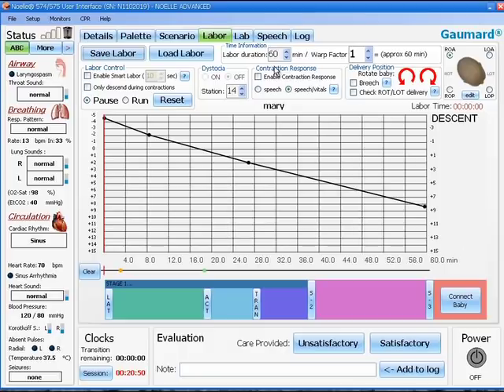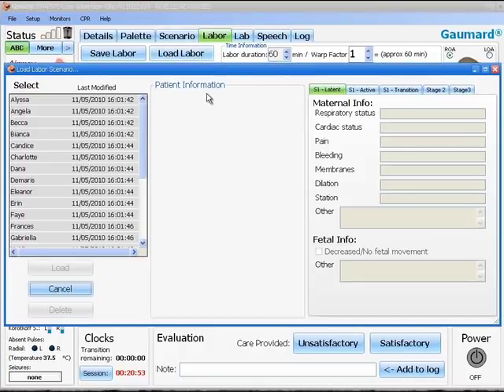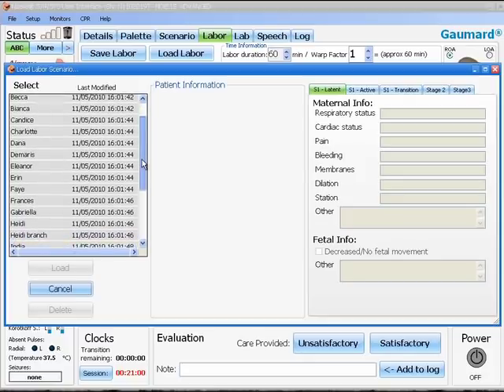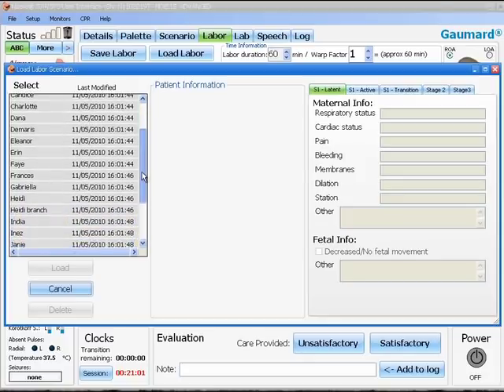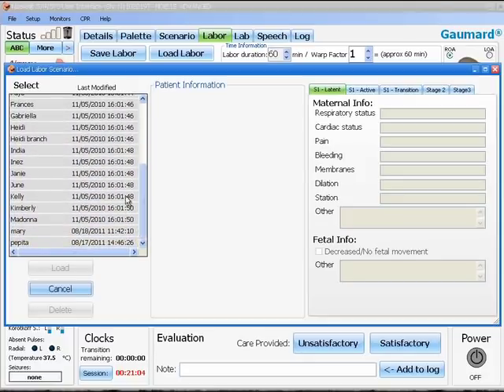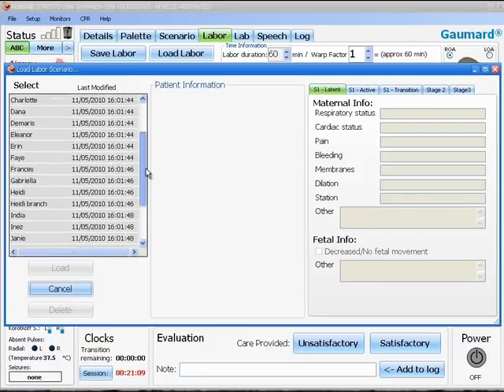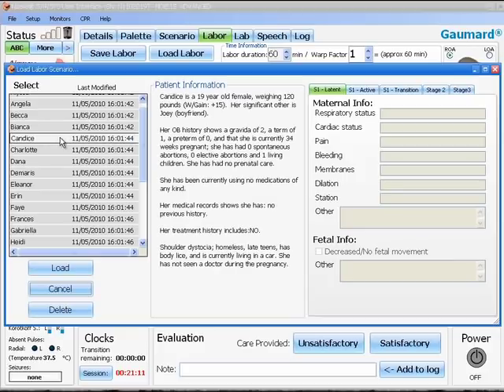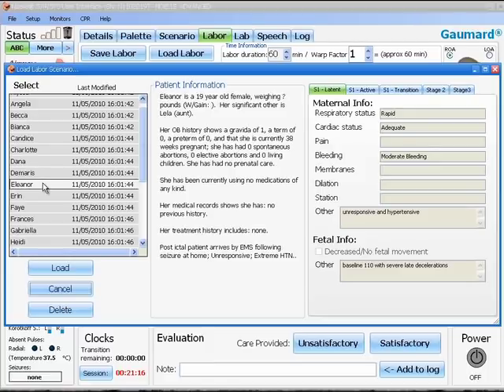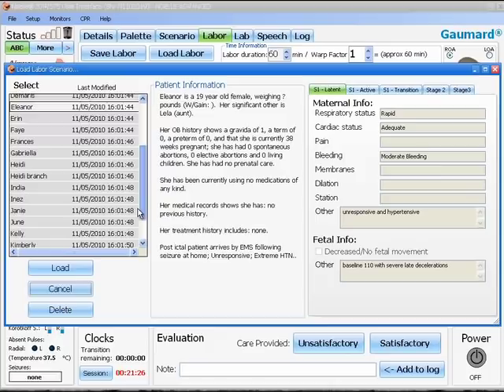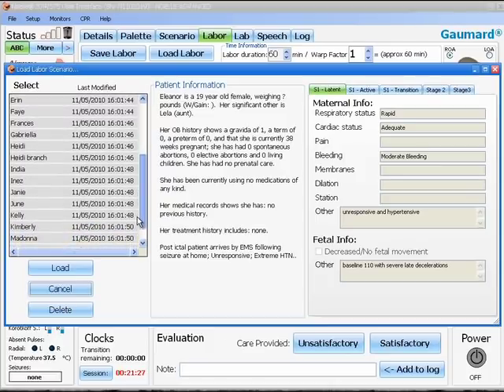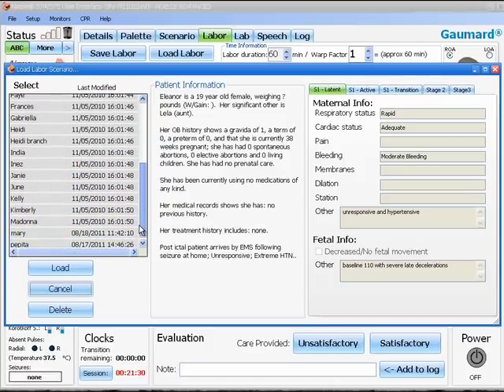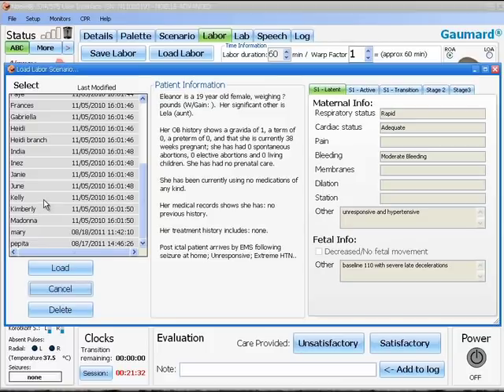Another word about your load labor scenario screen. When you bring up this window, you will notice that the maternal names are alphabetized. The A names are normal labors, and as you progress down the list, they become more complicated. For example, the C name of Candice is a shoulder dystocia. The E name of Eleanor is a preeclampsia scenario, which also features seizures. And as you go down the list, things become more intense with AFE and preterm labor scenarios.